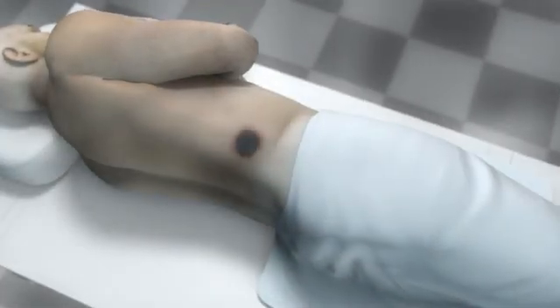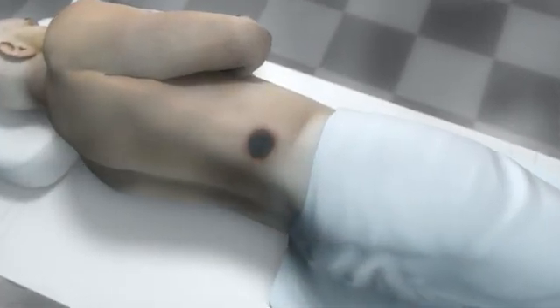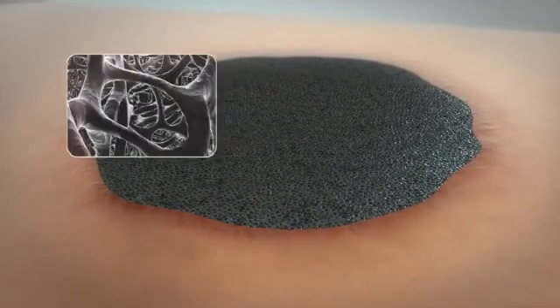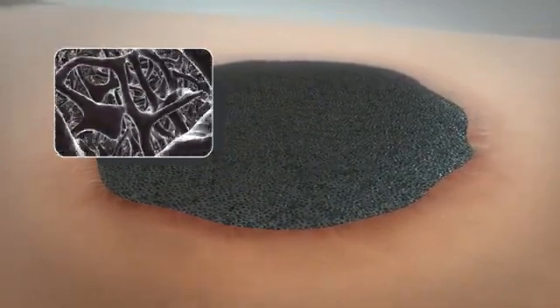When treating a wound using VAC therapy, KCI's proprietary granyo foam dressing, which is a reticulated open-cell foam, is placed directly into the wound bed.